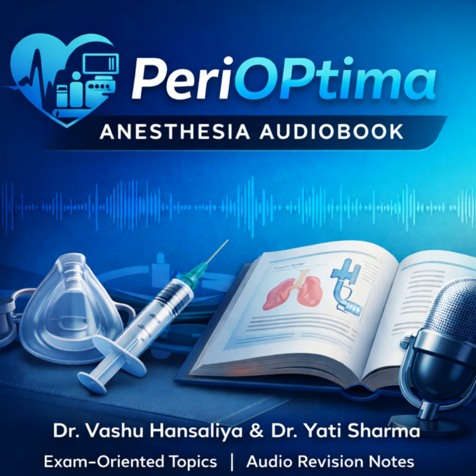Clinically, it frees up the anesthetist's hands. You don't need that continuous jaw thrust. It's also rapid and successful, even in the hands of non-experts in pre-hospital settings. Now, compared to the ETT, the benefits are really rooted in it being less invasive. So you get reduced hemodynamic and stress responses, a minimal increase in intraocular pressure, or IOP, and less reliance on heavy sedation. The pivotal point is that neuromuscular blocking drugs, or NMBDs, are not required for LMA insertion. And that facilitates faster recovery and turnover.